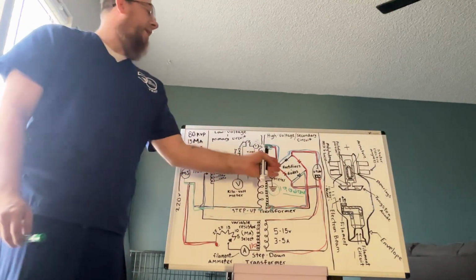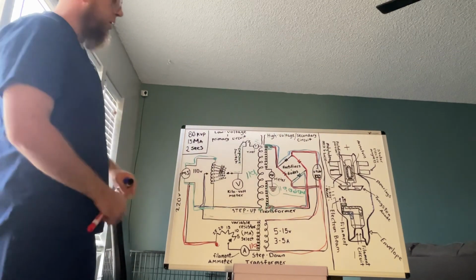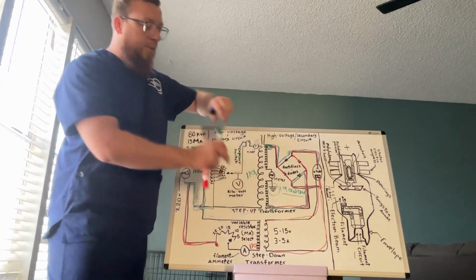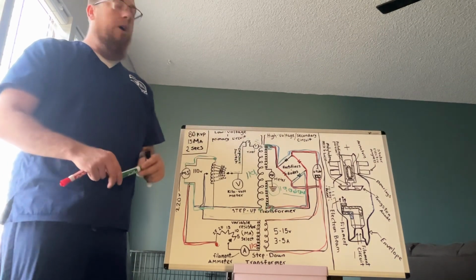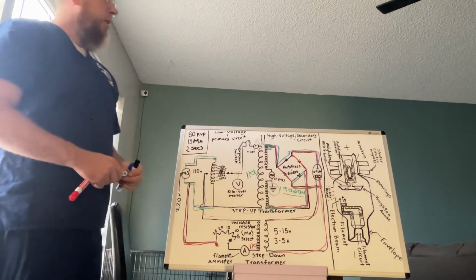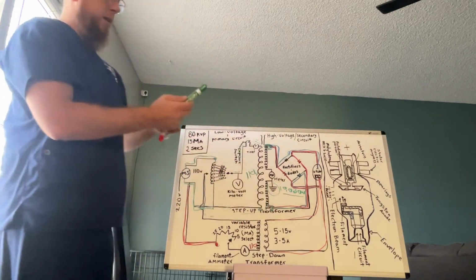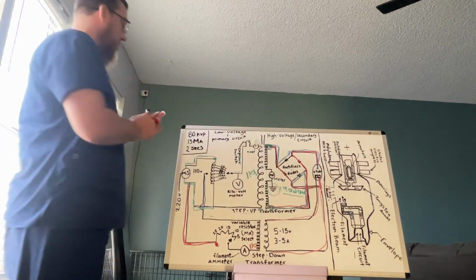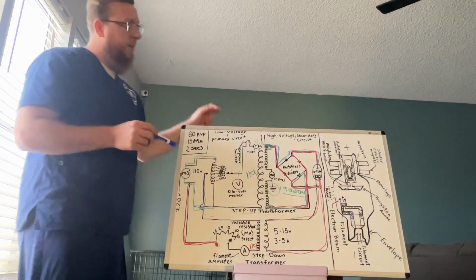Here we have our rectifiers or our diodes. If you remember, all this current that's flowing right now is alternating current, and what we need to do is convert that into pulsating direct current. That's what the rectifiers and the diodes do. So once it gets to the secondary portion of the circuit, it's going to start to rectify our alternating current, and it's going to do that in two ways.